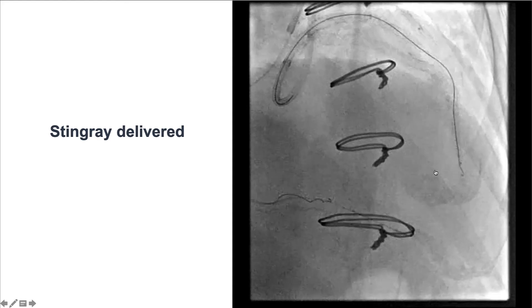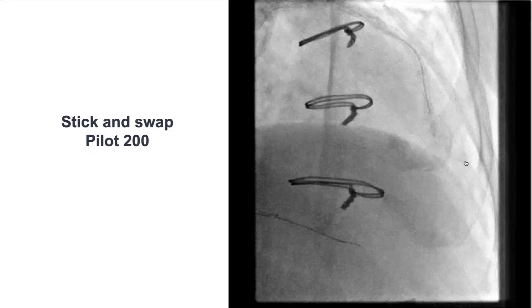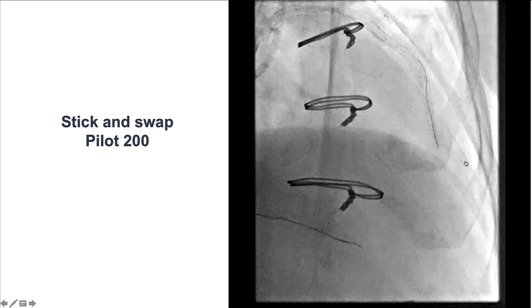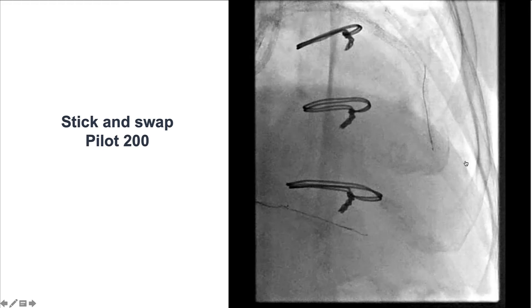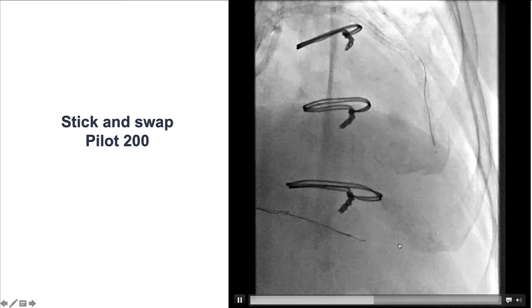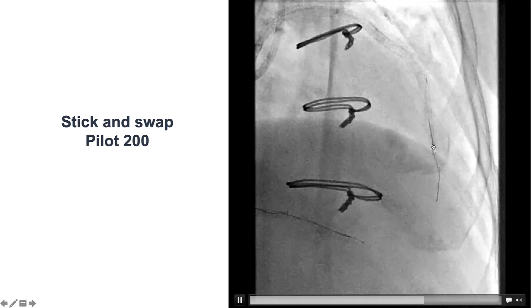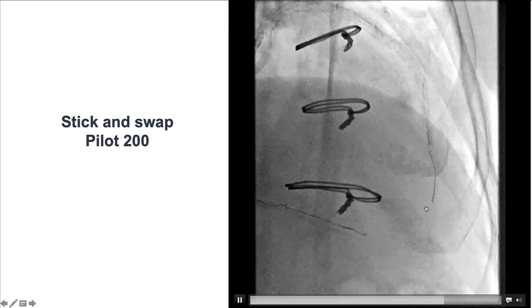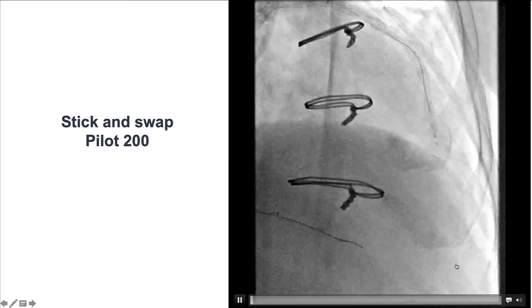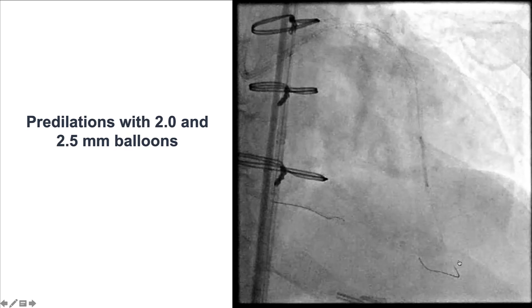We then used the Double Blind Stick and Swap technique, performing sticking through both exit ports and then exchanging for a Pilot 200. After a few re-entry attempts, the Pilot 200 successfully advanced into the distal true lumen, as confirmed by injection from the right coronary artery. We can see it exiting proximal to the proximal marker, then being redirected and eventually coursing down the LAD.